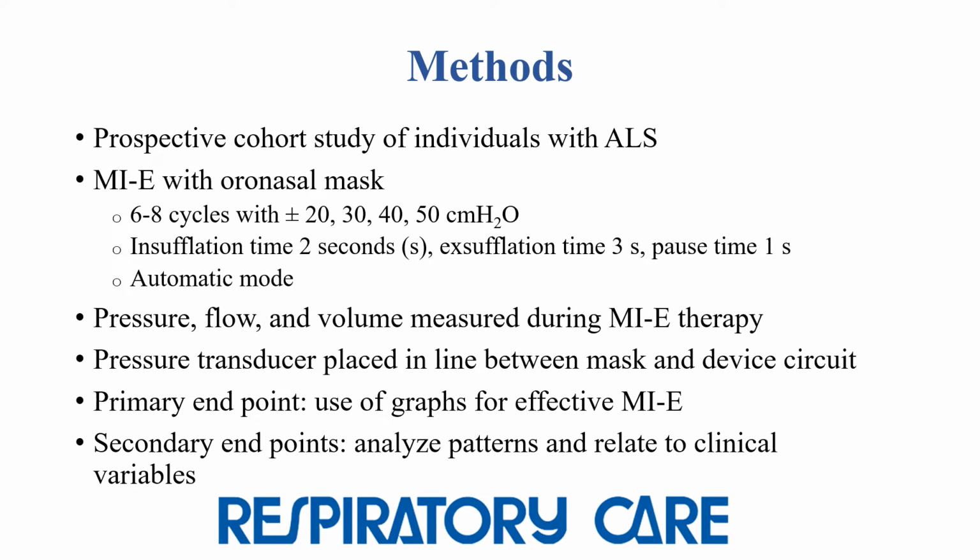Pressure, flow, and volume were measured during therapy with a linear pneumotachograph, and a pressure transducer was placed in line between the mask and the MIE circuit. The primary endpoint was to determine if the waveforms could be used to modify therapy settings for an effective treatment, and the secondary endpoints were to analyze the different patterns identified in the graphics and relate them to clinical variables.